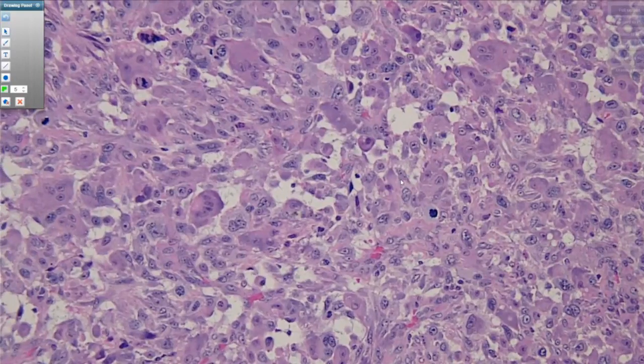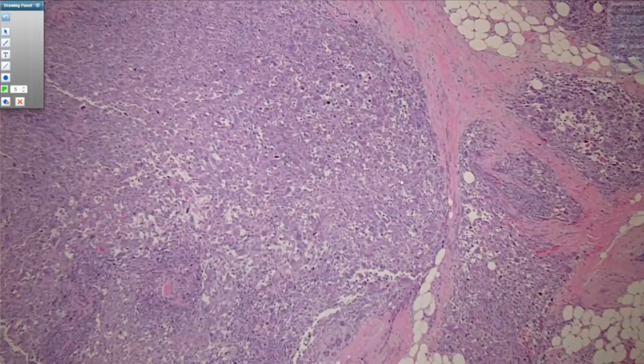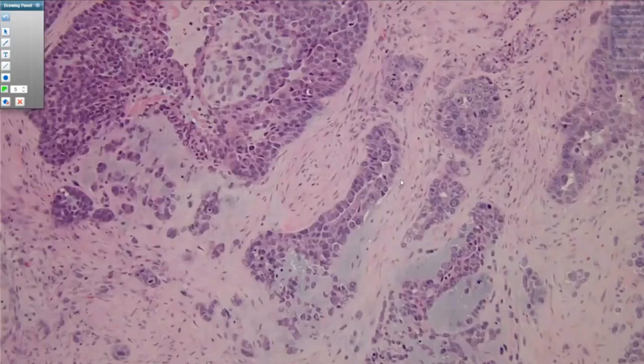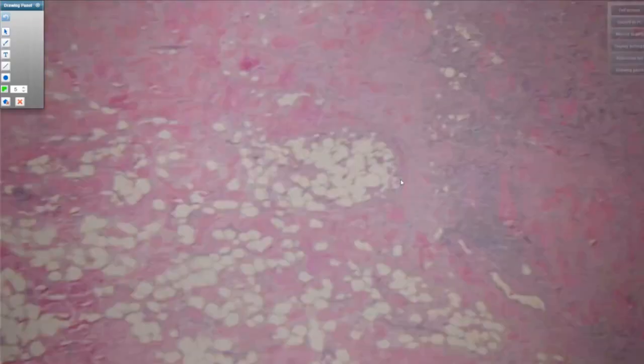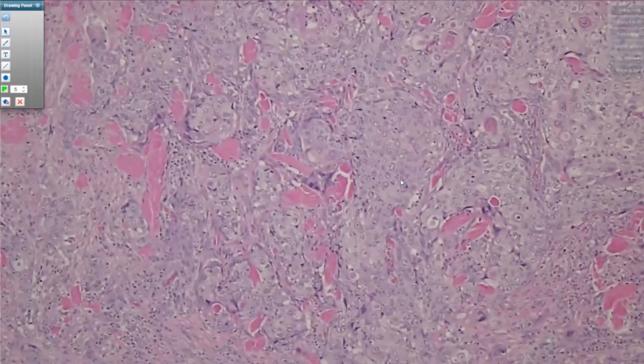As you know, metaplastic carcinomas can show a variety of heterologous differentiation, including, as seen here, the pleomorphic spindle cells. We can also see chondroid differentiation, as seen in this particular example. We can see epithelial type differentiation that is squamoid or squamous. And in these particular examples, it isn't so difficult to make the diagnosis of metaplastic carcinoma because these epithelial components are overtly present on the H&E sections.